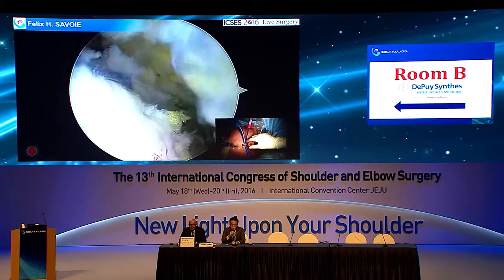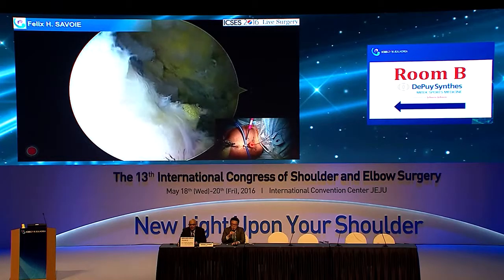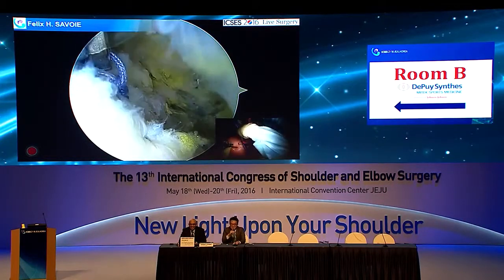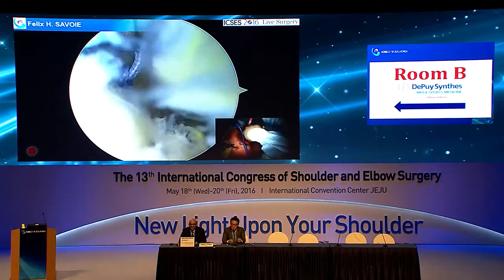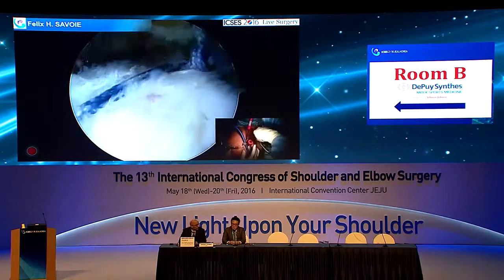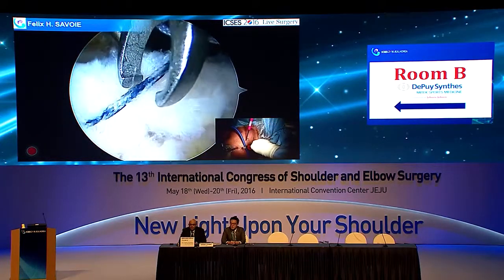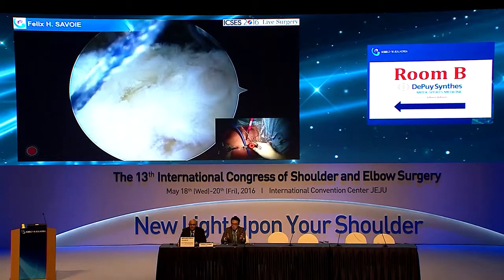Buddy, you're doing a left shoulder, and are you right-handed? I can change hands. This is surgery. It's not a hand thing. But what I'm trying to say is that a left shoulder for a right-handed surgeon is a little bit different. I put my portals differently from my right shoulders. Do you have any opinion on that, or do you do it differently from right shoulder to left shoulder? No. So that means you're bidextrous, or you can use both hands.